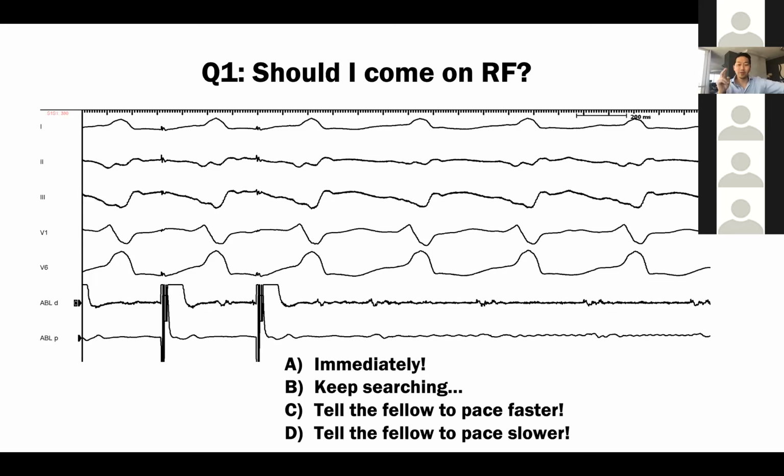The next question, which is what Phil's talking about, is I've got a lot of candidates here. How do I know which one I'm capturing? Well, that's the tough part. But the easiest way is to work back from your QRS and say, from my QRS here, what is the electrogram that I'm interrogating? I've got this option, and these noise options probably. You can see this is gained up. So there are multiple components, but our eyes gravitate towards the largest one. And that may or may not be a good thing.